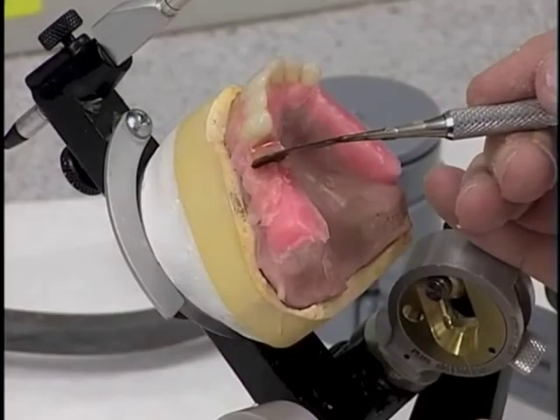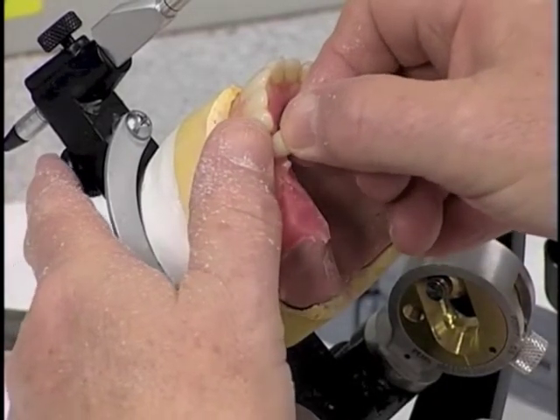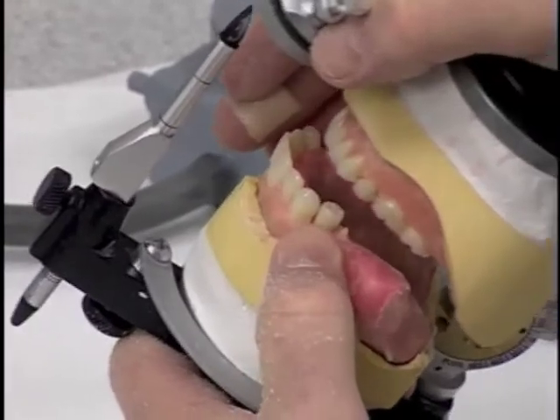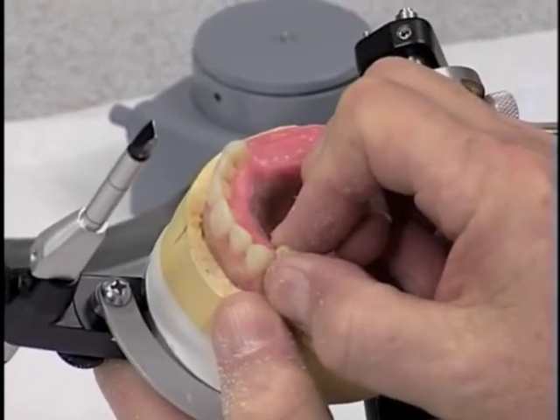Now that we've trimmed the tooth, we're going to pull the wax once again, attempt placing it into its proper position, close the articulator, and see if it'll go all the way in place without moving the tooth.